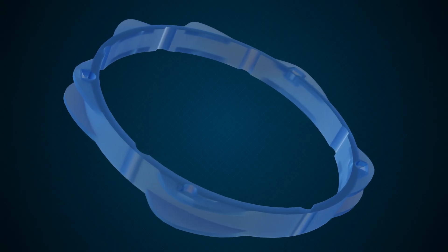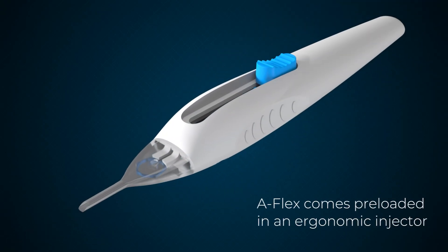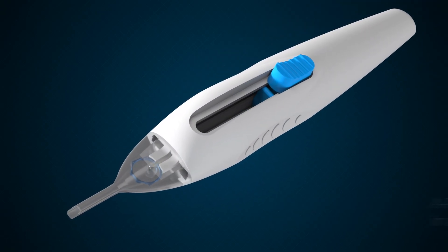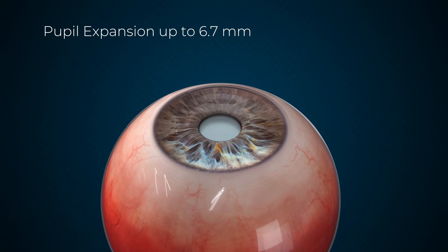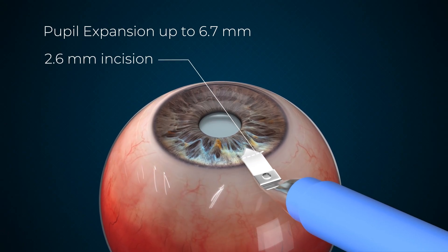Introducing AFLEX, a soft pupil expander for a revolutionary inside-out expansion. AFLEX comes preloaded in an ergonomic injector that is made for surgical ease of use. In the case of a small pupil, AFLEX is the perfect solution for an atraumatic pupil expansion up to 6.7 mm.